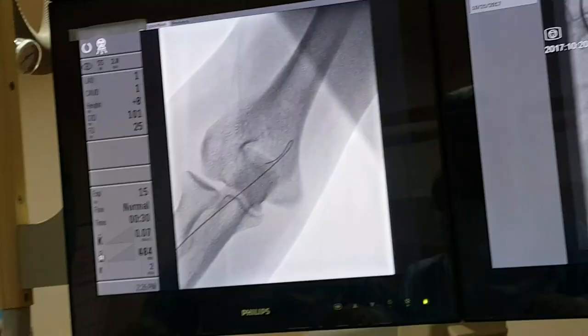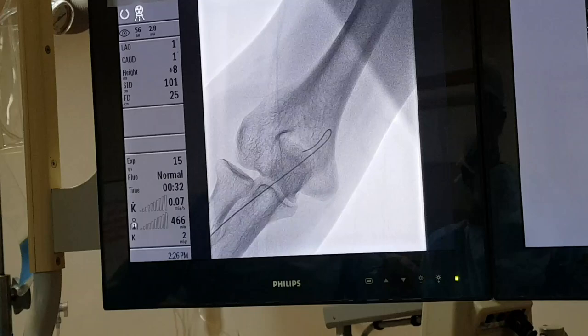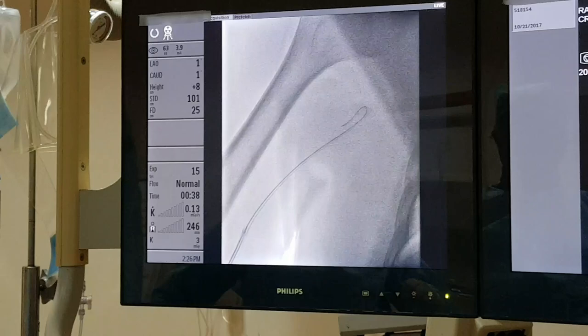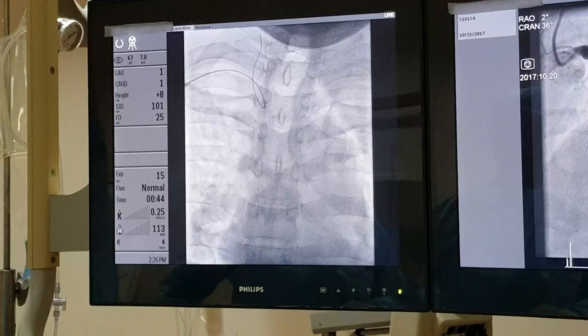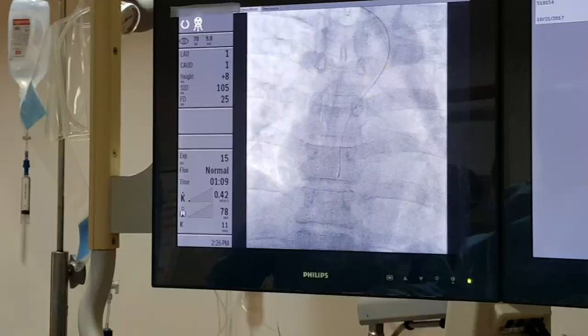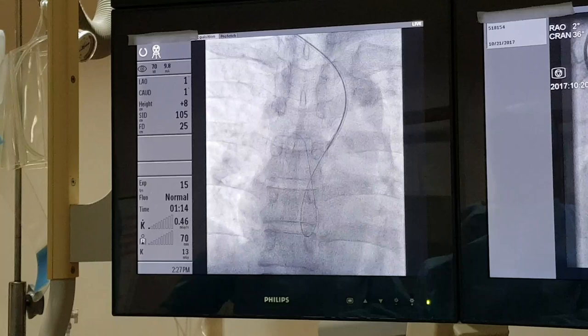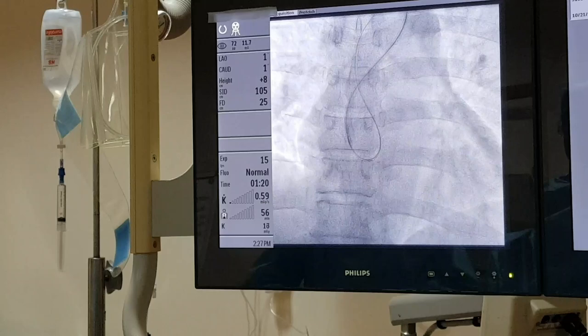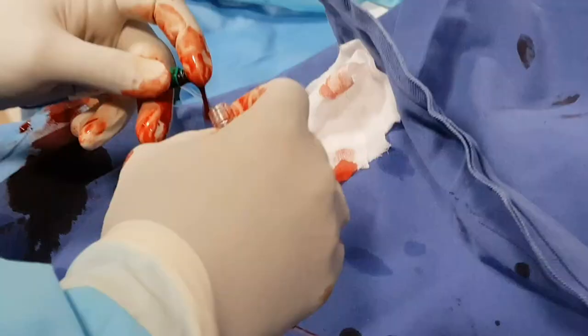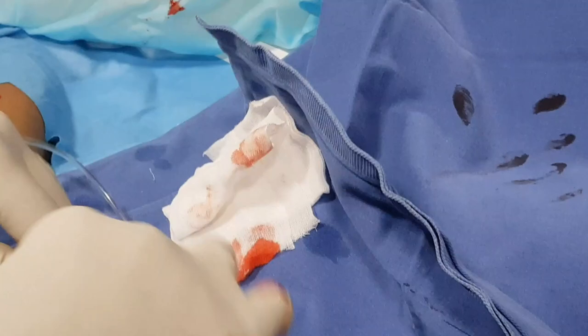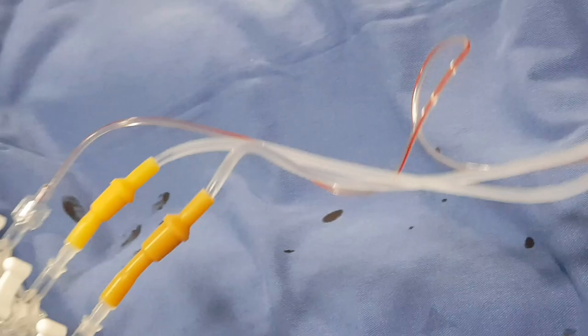Now I am advancing the wire into the aorta, and the guiding catheter is also advancing over the wire. Then I remove the wire and connect the Y-connector. This is called a Y-connector, and it is connected to the manifold. Through this manifold we can measure the blood pressure of the patient, and it is also connected to the dye or contrast to visualize the arteries.